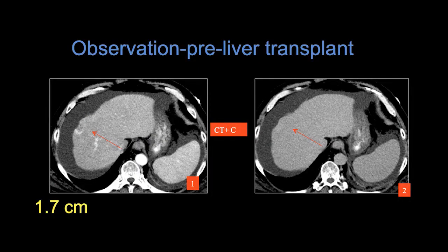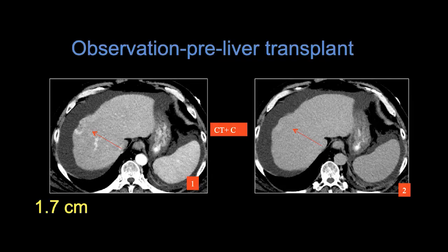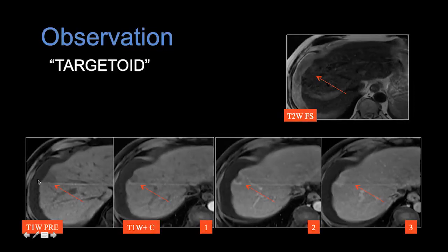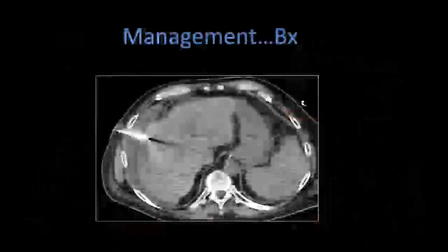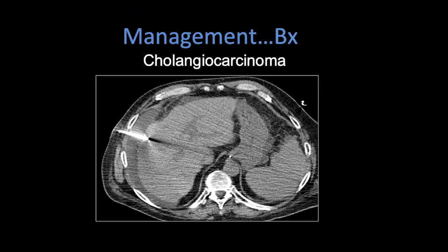Here's a case: a patient with cirrhosis and ascites. We have a rim-enhancing lesion within the cirrhotic liver. Notice there's capsular retraction and progressive enhancement — this is not diagnostic of HCC. On MRI, we see a targetoid appearance on T2, rim-like enhancement on the arterial phase with progressive enhancement, and capsular retraction. This does not meet the imaging features of HCC. The patient ended up getting a biopsy at our recommendation, and this ended up being, as expected, a cholangiocarcinoma.